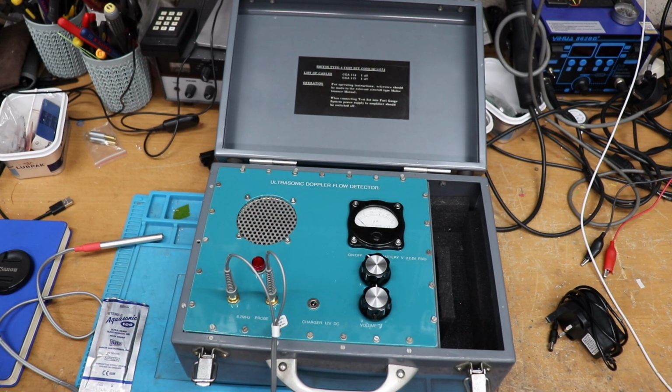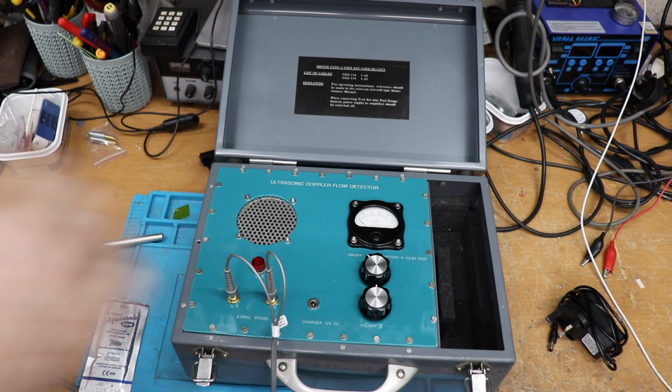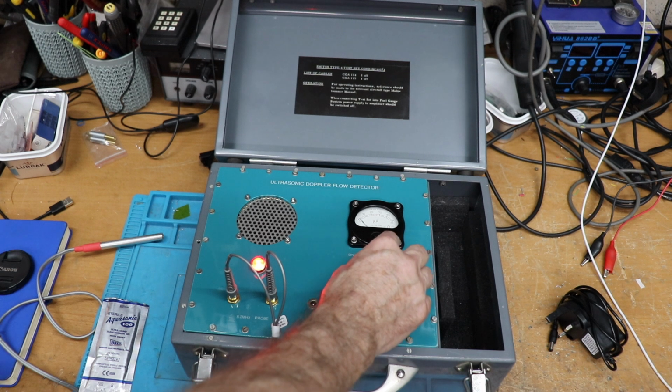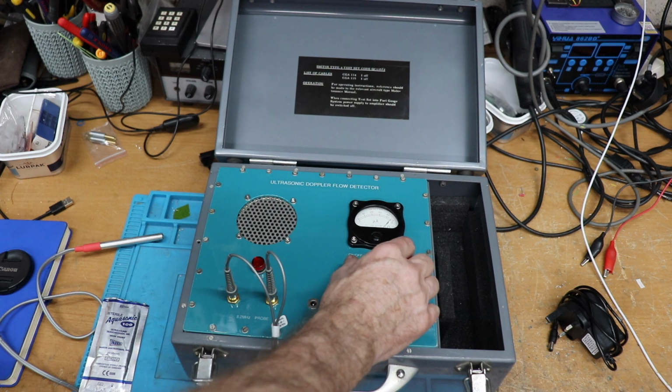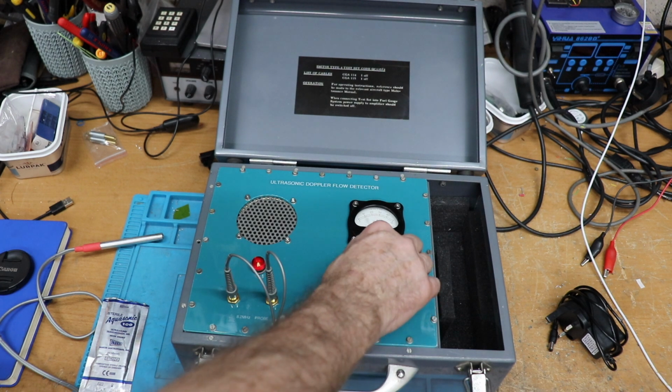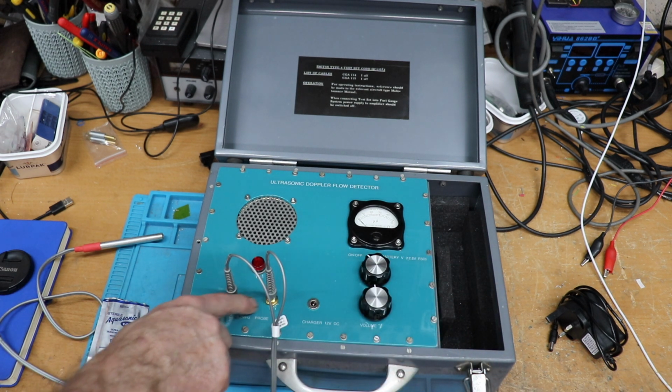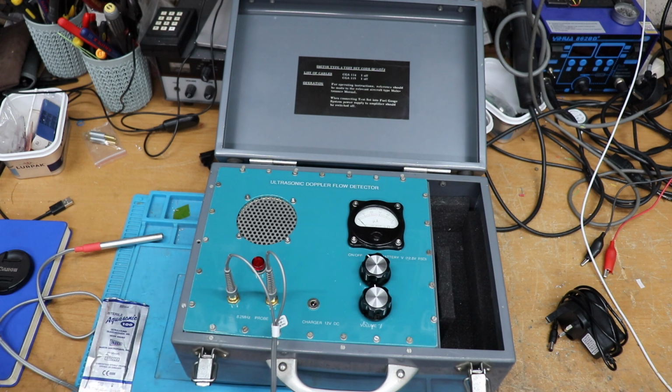So as you can see, this is the Doppler machine that I've made. There's not an awful lot to see in terms of the controls. There's not much to it really. You've got on off, that's a VU meter, which isn't terribly sensitive. There's a rechargeable battery, and that gives you your battery volts. You've got a volume, and then we've got the two plugs here for the probe. I'll show you the probe in a minute because it's actually quite interesting. You can see how it's been made.